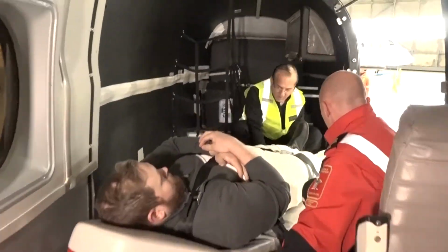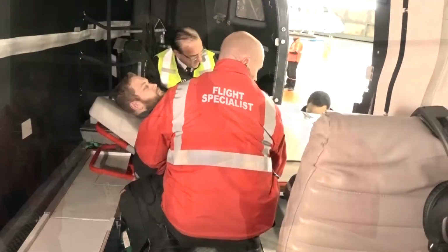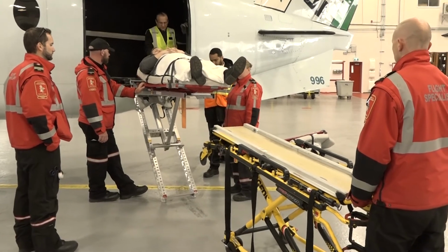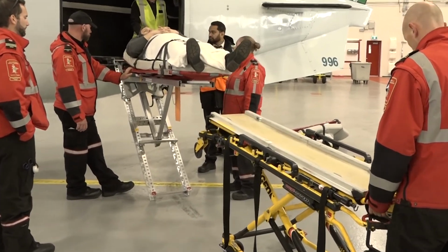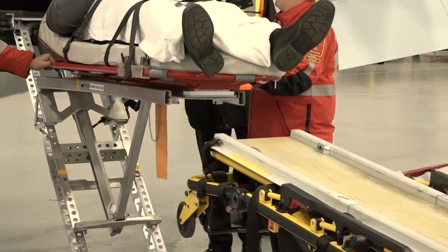When unloading the aerosled, the height of the stretcher should be positioned lower than the ramp to allow gravity to assist with the transfer. The brakes of the stretcher should be engaged. The person who has remained in the aircraft will be the in-charge person, coordinating all movements.